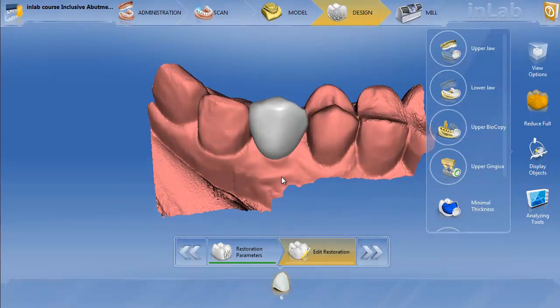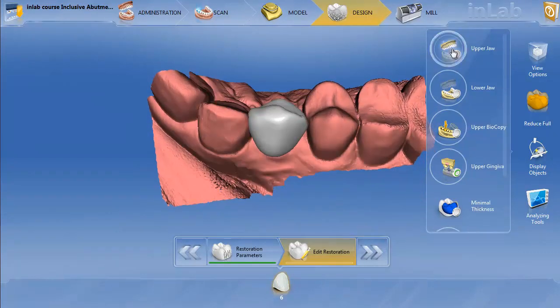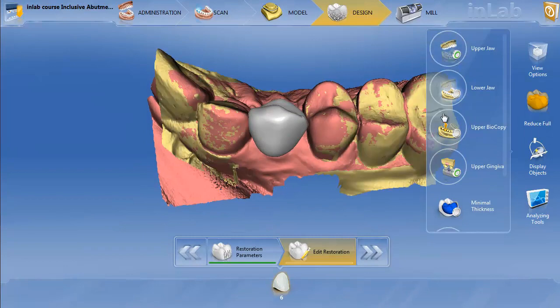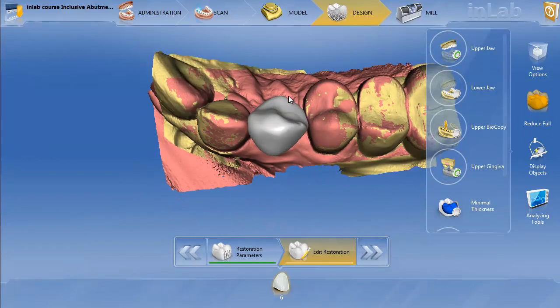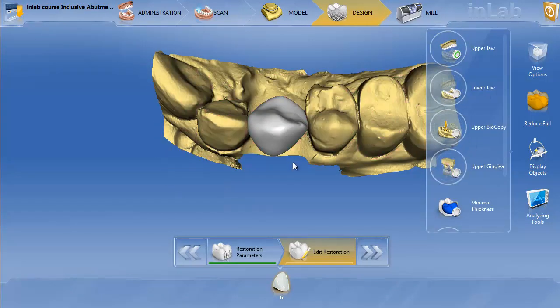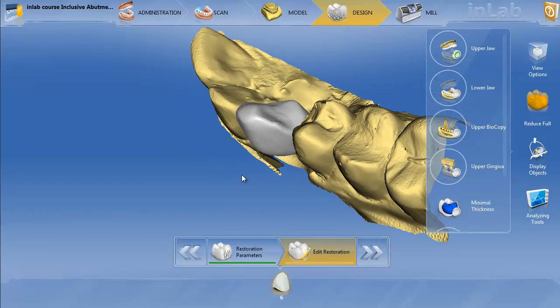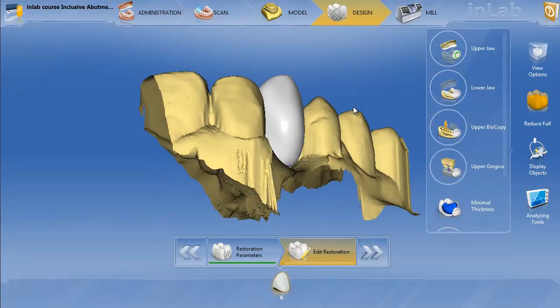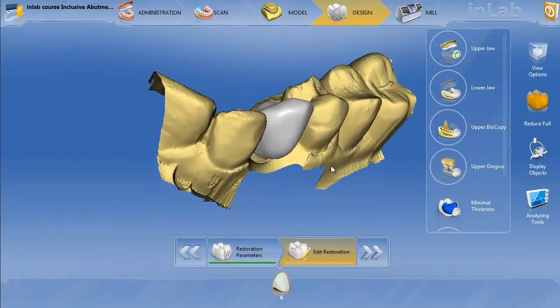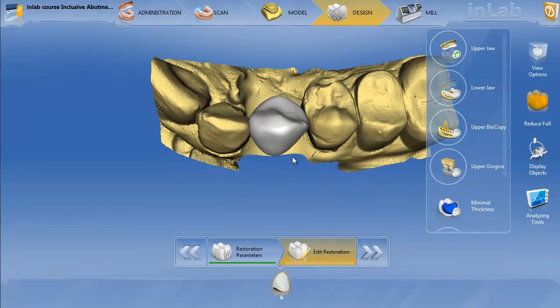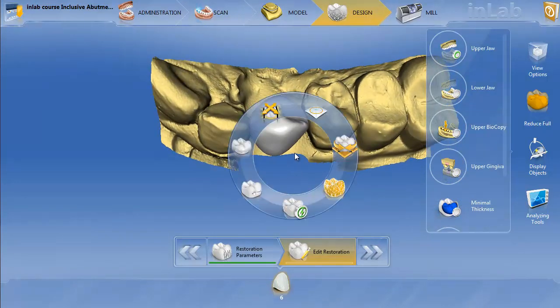So what I'm going to do here — if I want to go ahead and make a custom Emax abutment — we'll turn this back on and turn the gingiva off. What I'm going to first do is finish the restoration design, which it is, and then right-click and hit reduce.